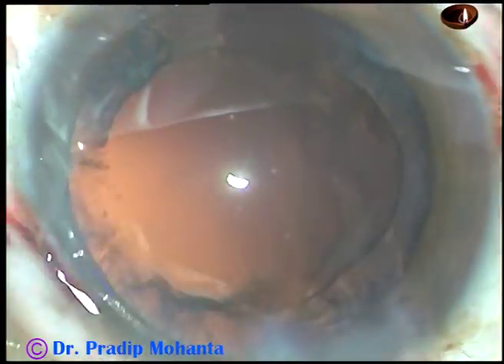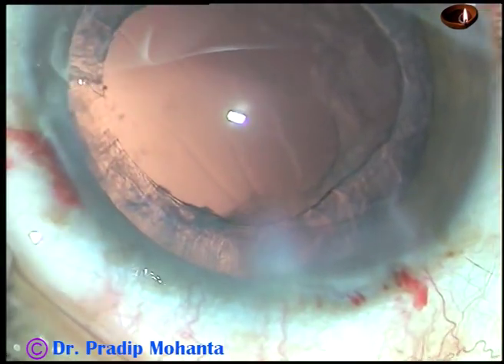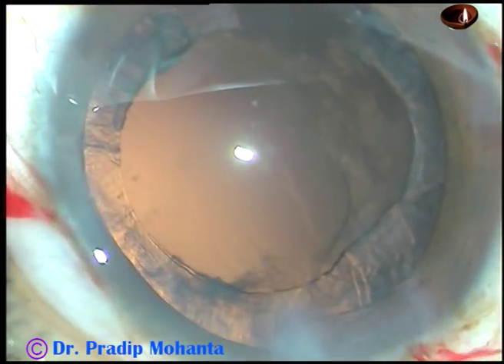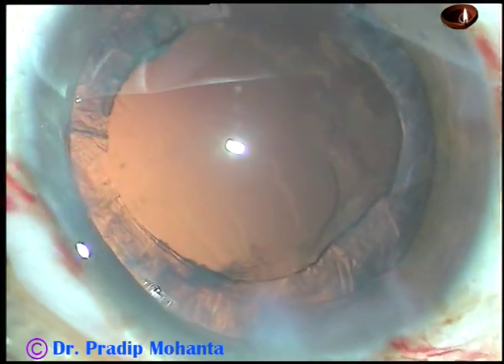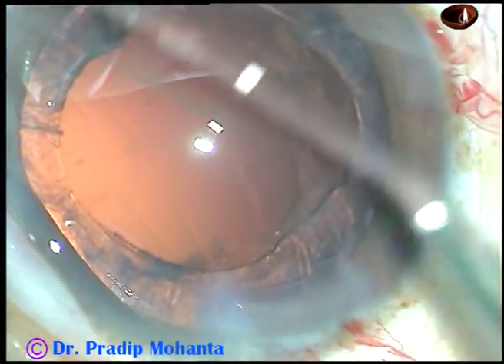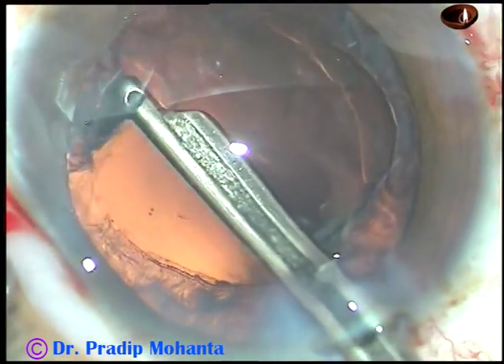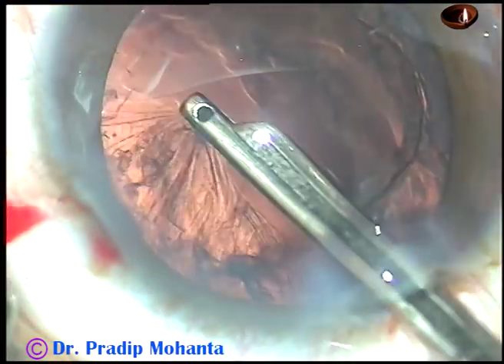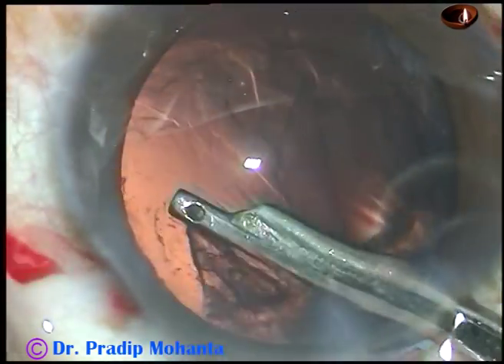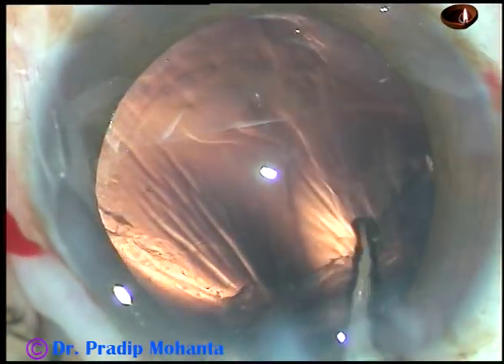And now inject a little bit of visco, and this is the time to clean the cortex. I take a 23 gauge Simcoe cannula attached to a 10 cc glass syringe, and see how beautifully you can remove the cortex with this very simple instrument. Yes, the cortex is getting removed very nicely.